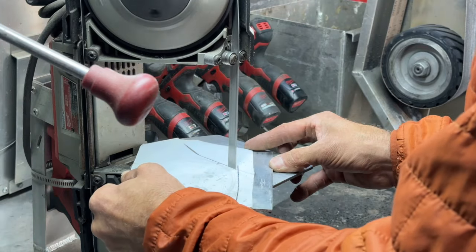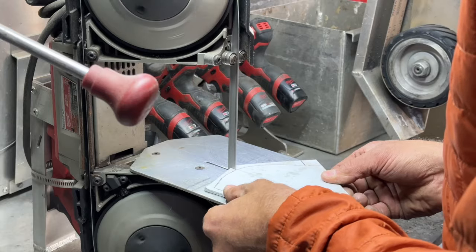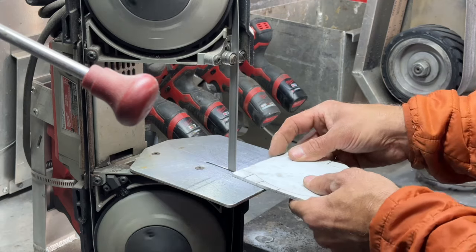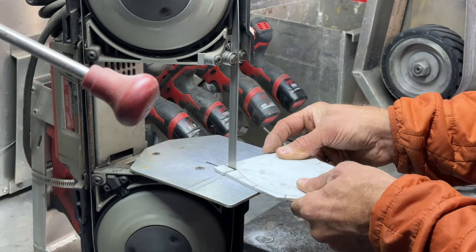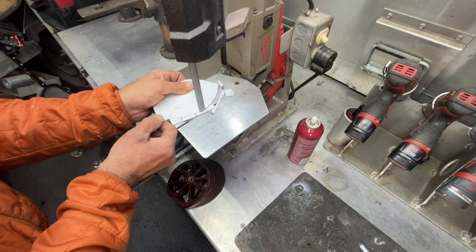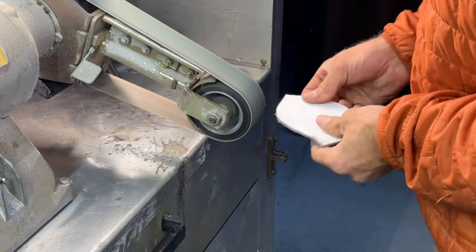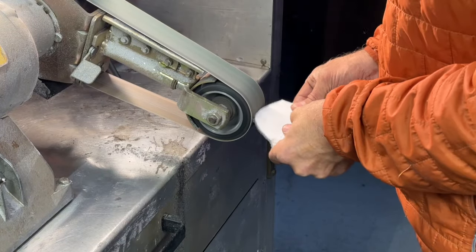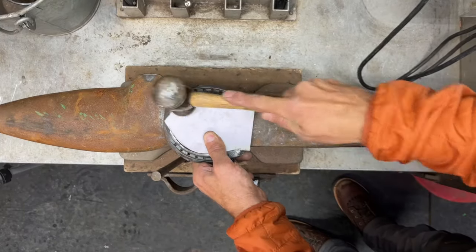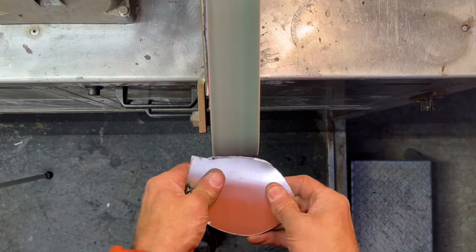Once your plate is cut roughly to size, draw a line so it's easy to see where your relief cuts need to end. I do this so that when I start cutting along the template line, it is easy to stay along the curve of the plate. I then use a grinder to fine tune any aspects of the plate that are a little bit coarse. Hammering the plate into the center of the shoe will show you where there's any excess material that needs to be removed.